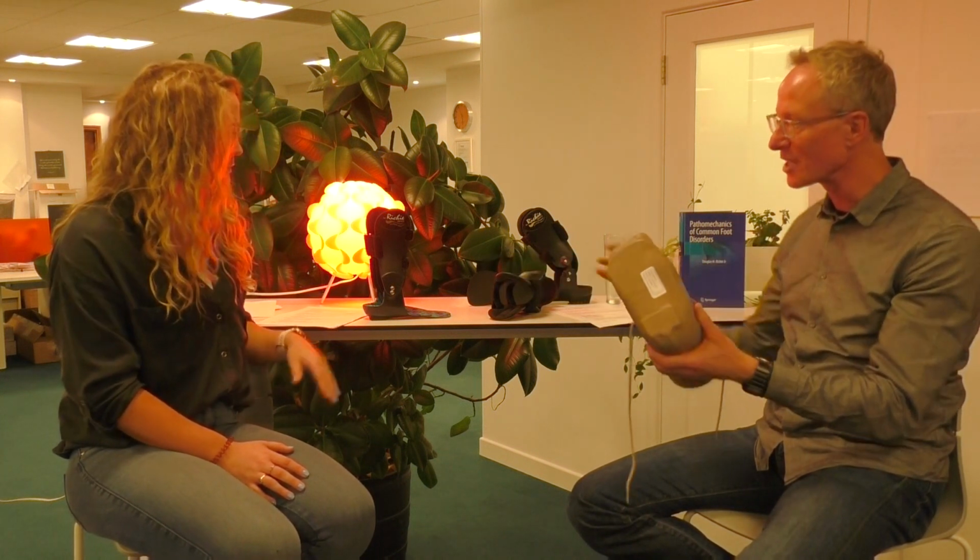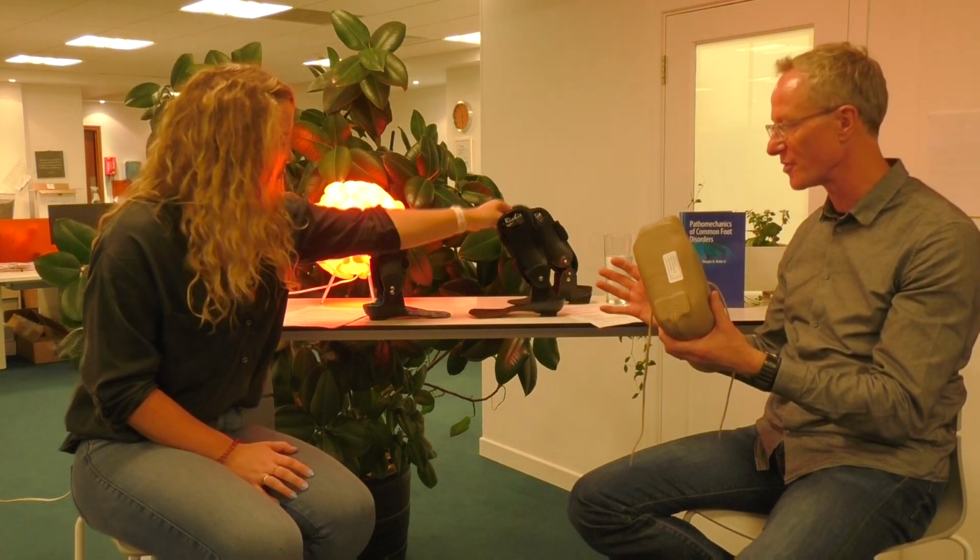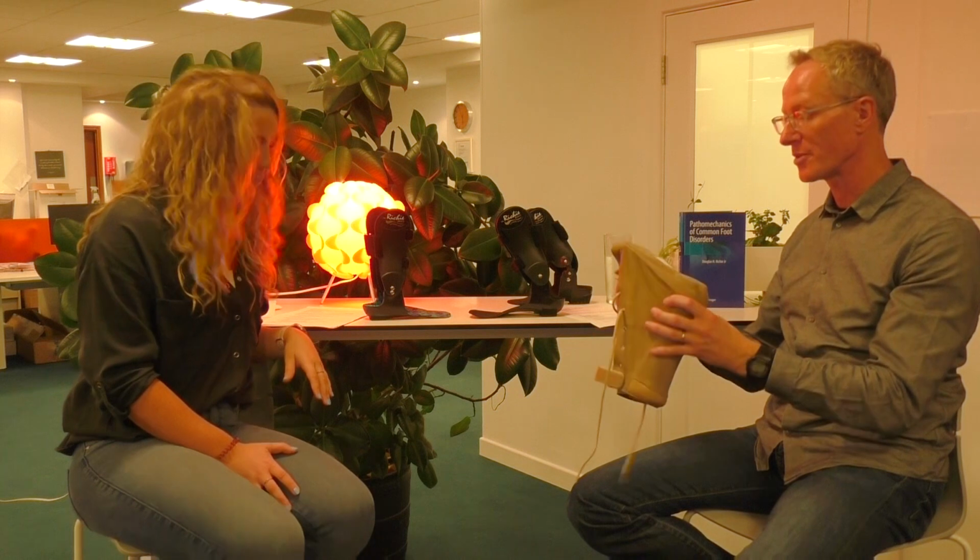You can get a 7-inch or a 9-inch, so it gives you this back slab. Again, the foot plate itself is intrinsically balanced, but in many cases it's neutral as it sits because the foot's arthritic, you can't change it. Whereas in these ones you can actually control the position of the foot with your casting. So we'll talk about that when we come to the pathologies in a moment.